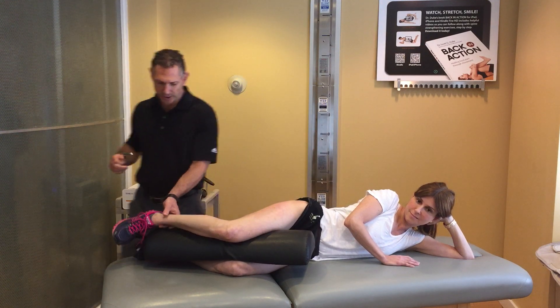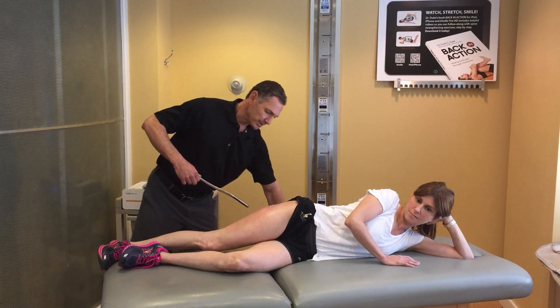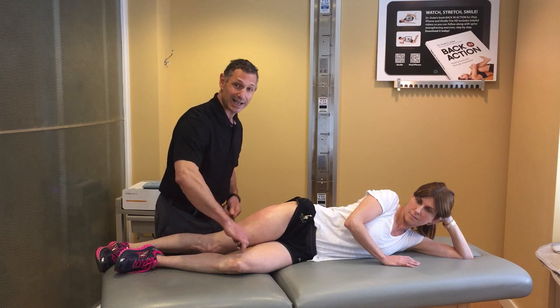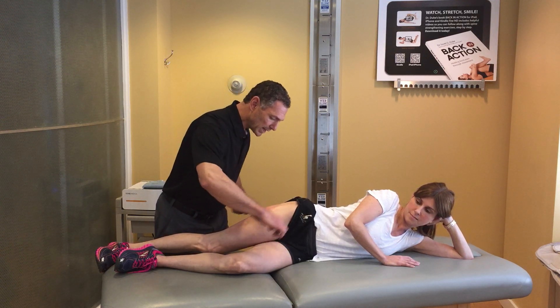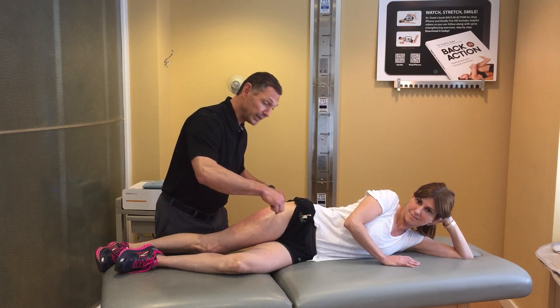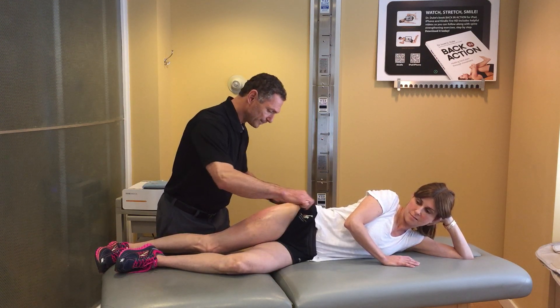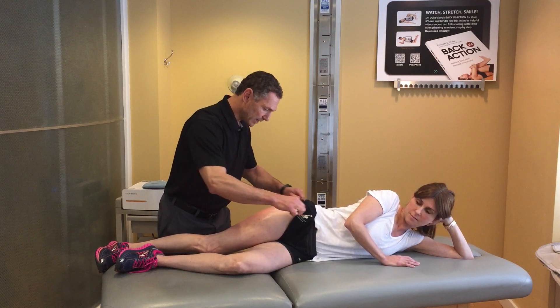I like to first take a Graston instrument to get rid of some of the superficial scar tissue that limits slide and glide — to the IT band, to the quad, to the hamstring, to the glute medius, to the tensor fascia latae. In our office I would use this instrument a lot longer than what I'm doing right now.